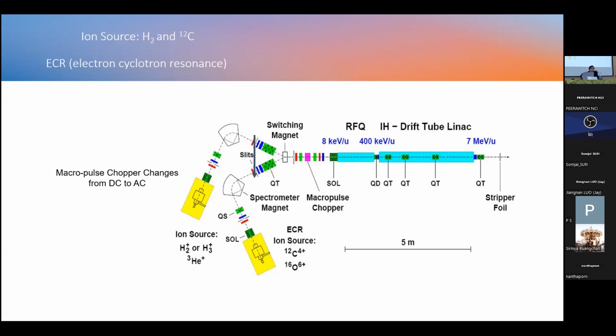It's important to talk about this and understand it when you're first thinking about building, if you're going to go synchrotron, and spend a little bit of time, because the collaboration here is with a center that may be putting in a synchrotron type system. The energy that you inject into your synchrotron, that initial energy, has a lot of influence downstream.